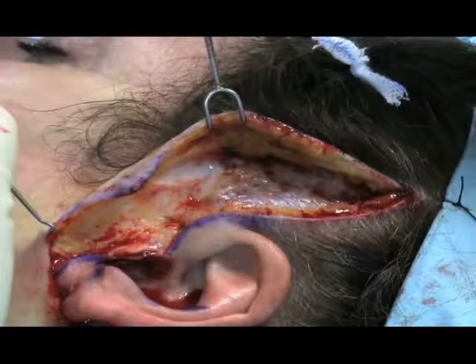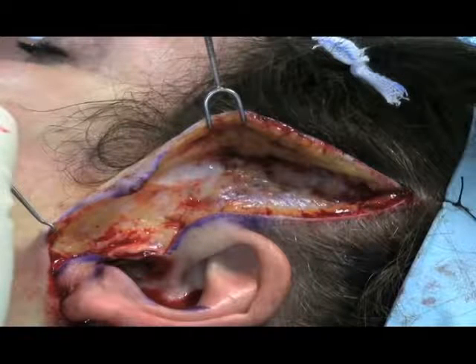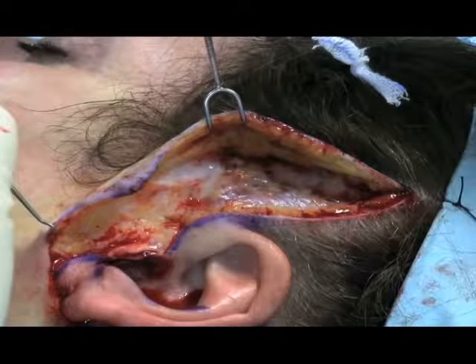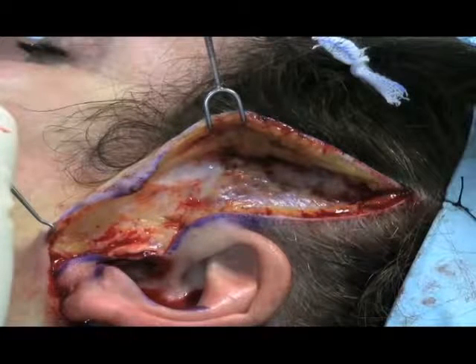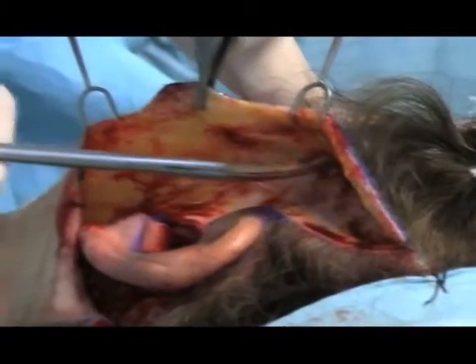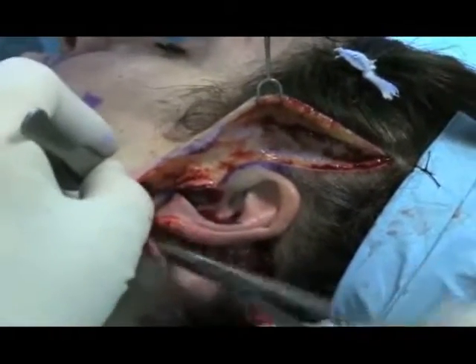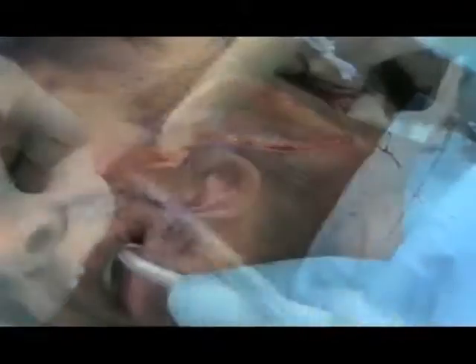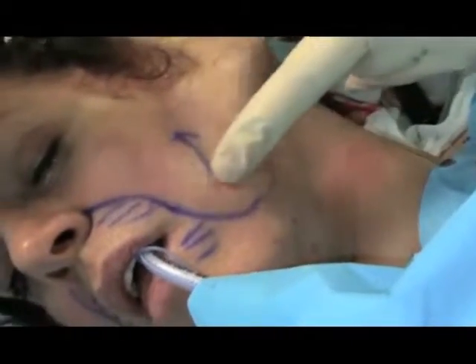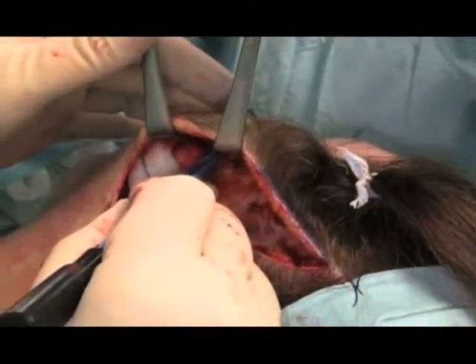It is important to dissect in the correct plane, which is shown well here, to be just beneath the hair follicles, leaving a thin layer of subcutaneous fat on the fascia. Dissection proceeds anteroinferiorly in this plane. Meticulous hemostasis is performed.